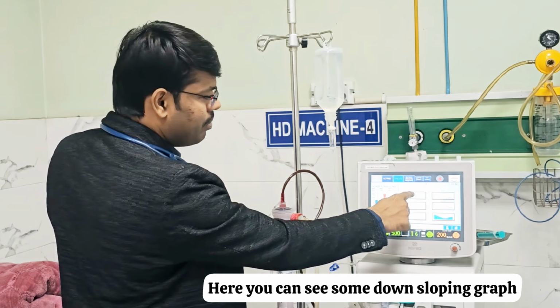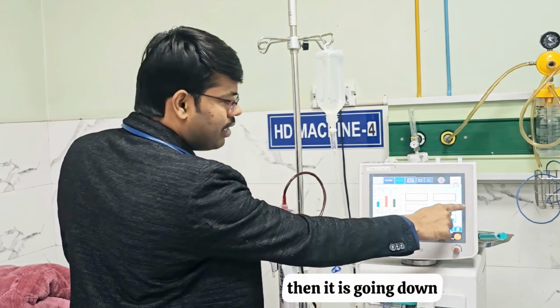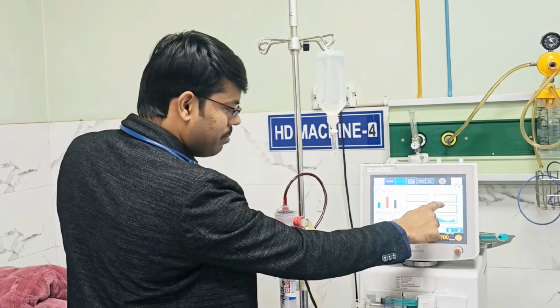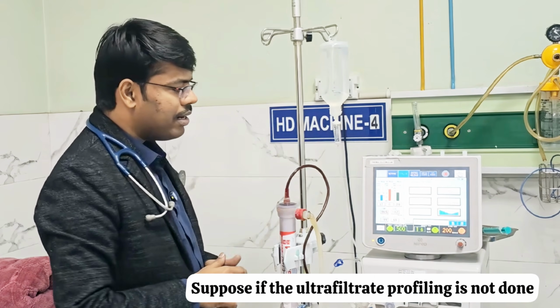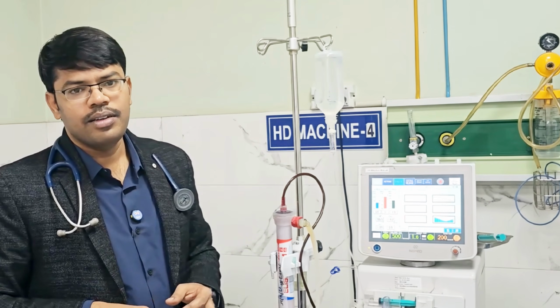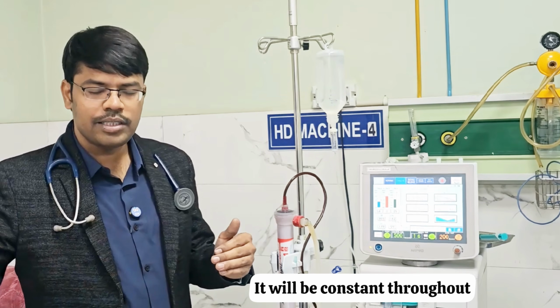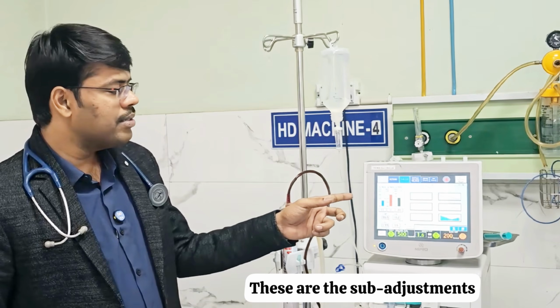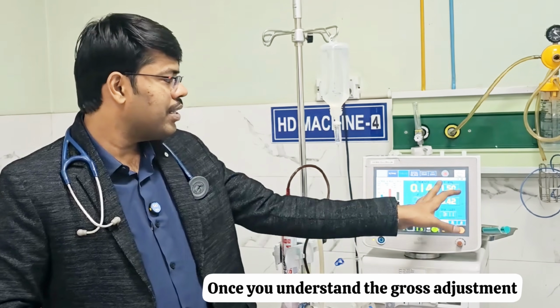Here you can see some downsloping graph. Here initial 3 bars are same, then it is going down. Here initial 3 bars are same, but suddenly it is going down and coming to normal. Suppose if the ultrafiltrate profiling is not done, a particular rate will be removed constantly. Every 20 minutes, 200 ml. It will be constant throughout. Depends on the final ultrafiltrate you fixed. These are the sub-adjustments, which will come once you understand the gross adjustment.